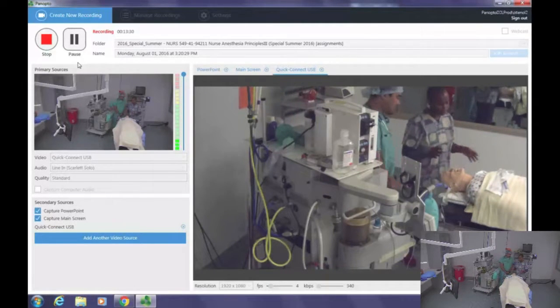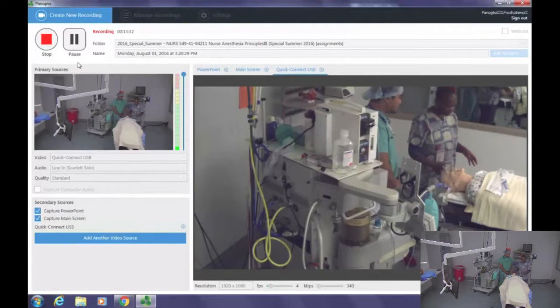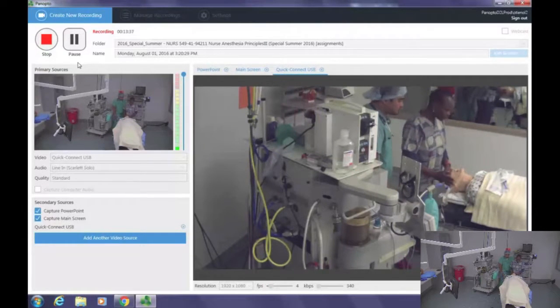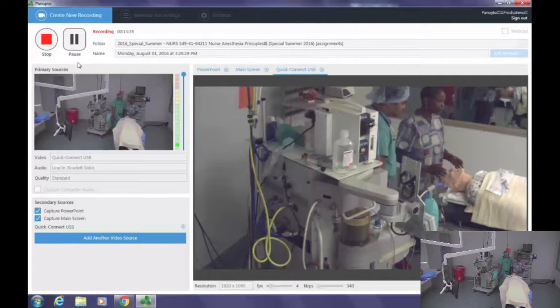Like I said, we already pre-medicated the patient in the holding room with Versed. So what we're going to do right now is explain to Mr. Dooley that the induction plan is going to be standard. I am going to explain what we're going to give him, for the viewer's benefit. My induction plan today is general anesthesia.